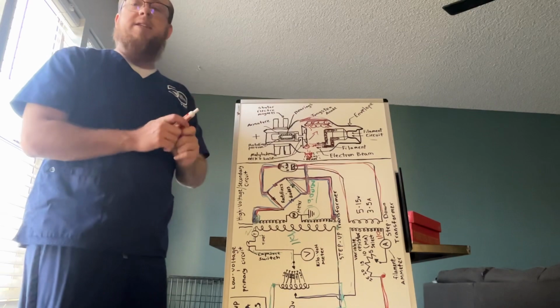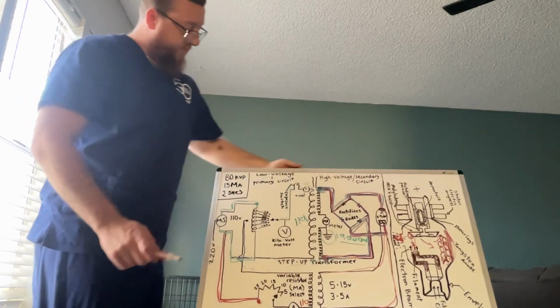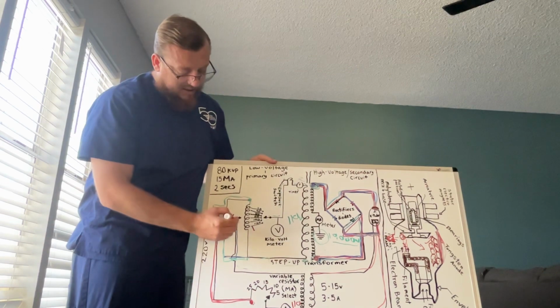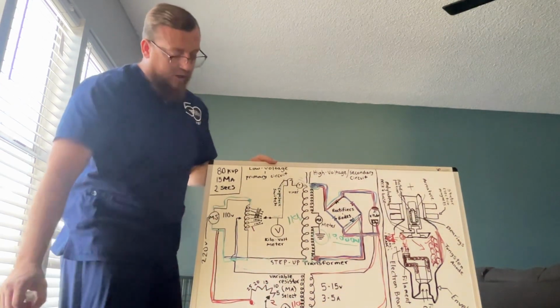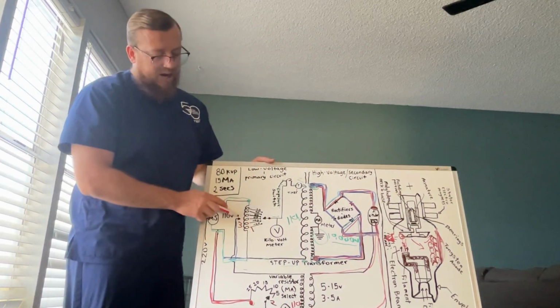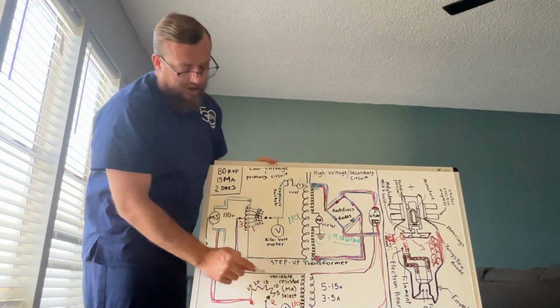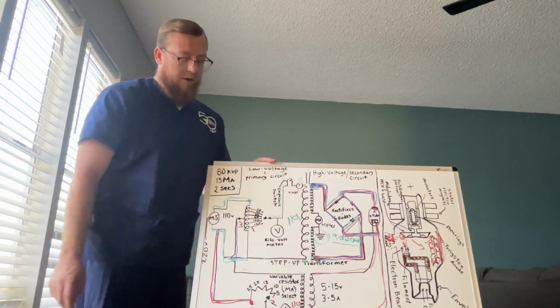Oh, before I stop, 6 points of induction. First point is going to be here. Second point is going to be down here with our selector. Our third point is here. And the reason why these are inductions is because if this was direct contact, if you follow this line down, you see that it goes to the MA selector or the variable resistor.